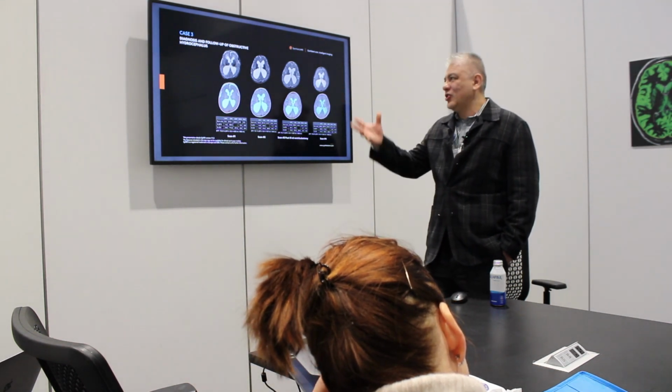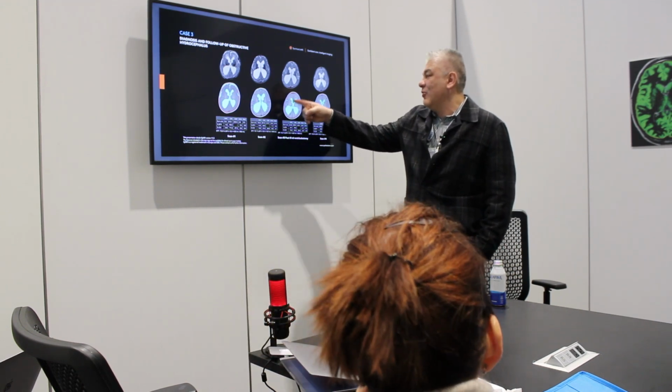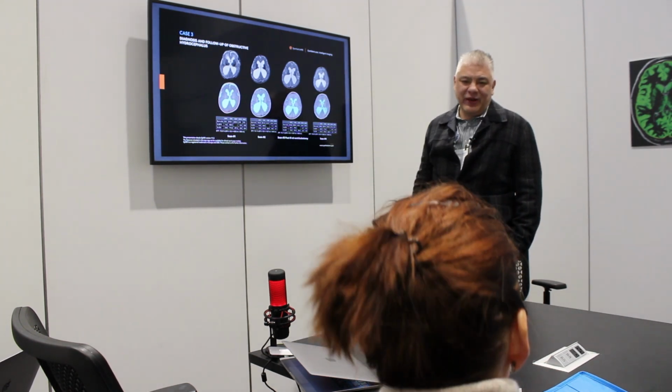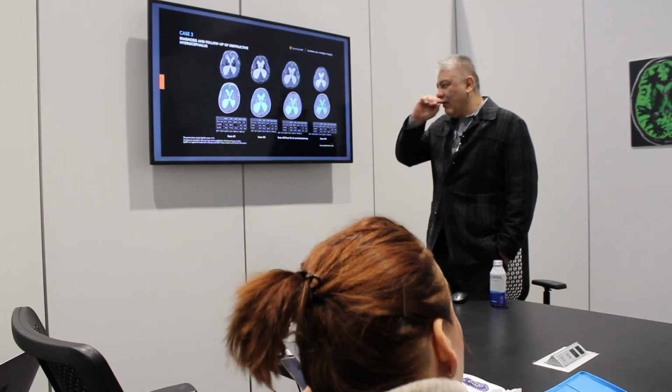I mean, how much? It would be great to be able to say what amount of CSF is in the subarachnoid spaces and what amount is in the ventricles. That would be great. We can't say that yet. But that we cannot say.